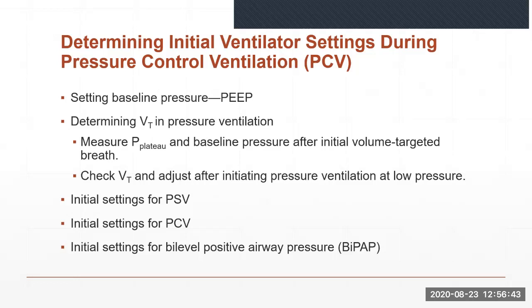Compared with similar settings on volume control CMV, pressure control CMV has been shown to improve oxygenation and gas exchange, increase mean airway pressure, and facilitate lung healing. Pressure CMV also reduces the PIP, the amount of applied PEEP, minute volume, respiratory work, the need for sedation, and the duration of mechanical ventilation.